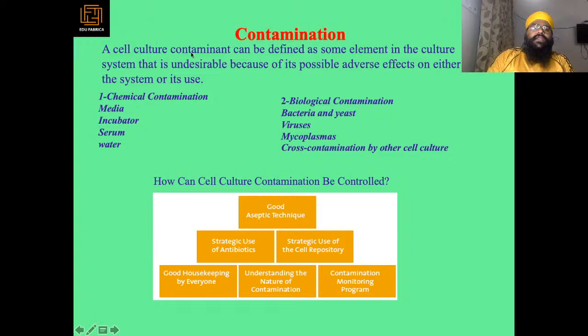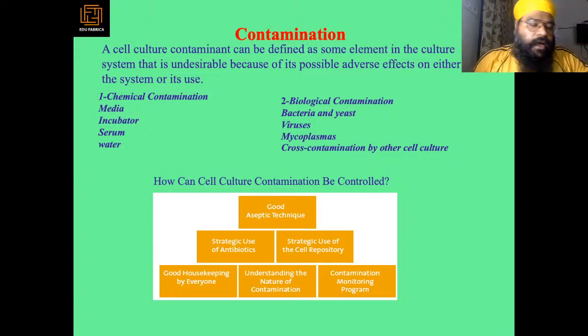Then contamination. So cell culture contaminants can be defined as some elements in the culture that are undesirable because of their possible adverse effect on the system.